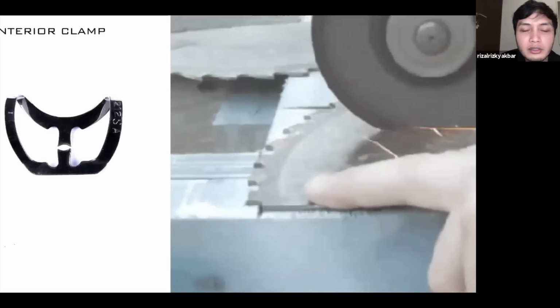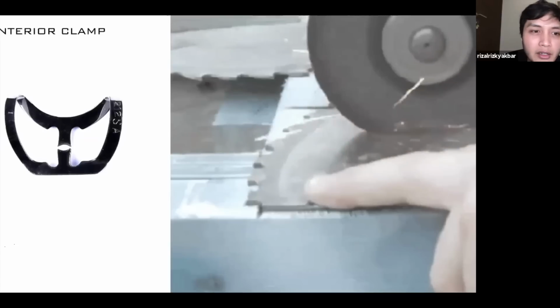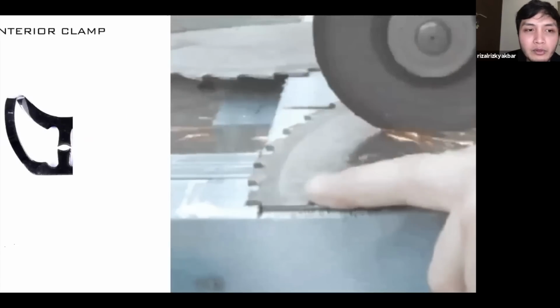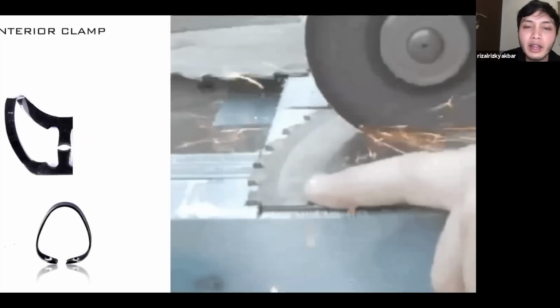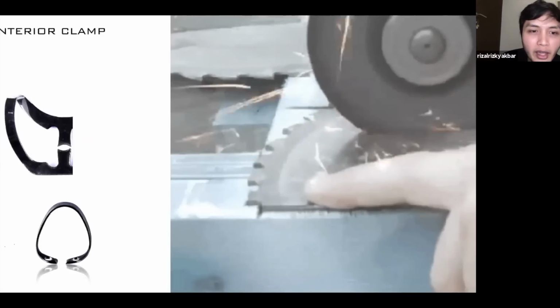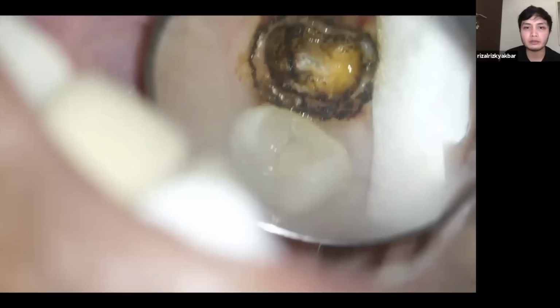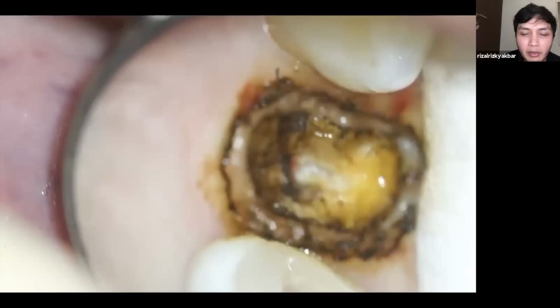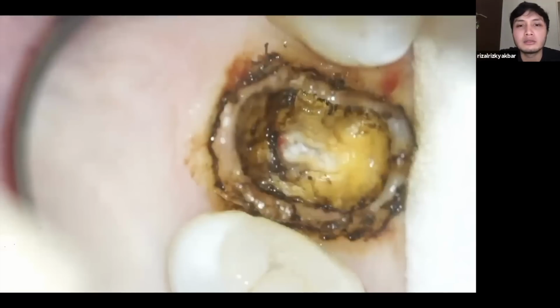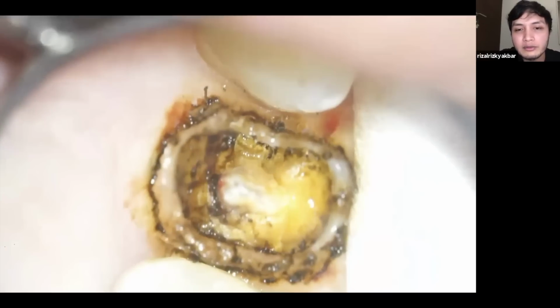And the other tool that helps you a lot is the anterior clamp, but cut in half. This is a modified anterior clamp, the 212 clamp, and then you can cut it with burs, and you can make it into a retraction clamp. Actually there's an actual retraction clamp called the Brinker clamp from Coltene, but I found it's not stable compared with the modified anterior clamp that I cut in half.